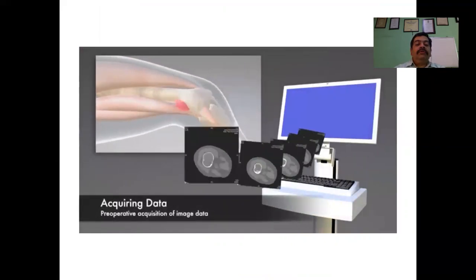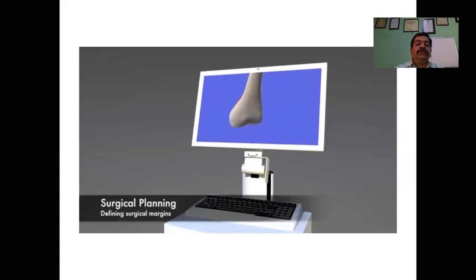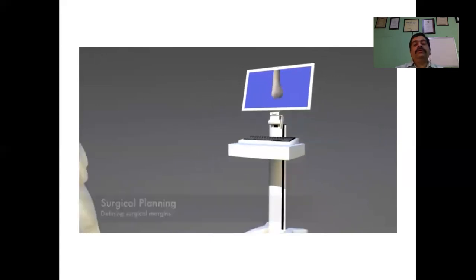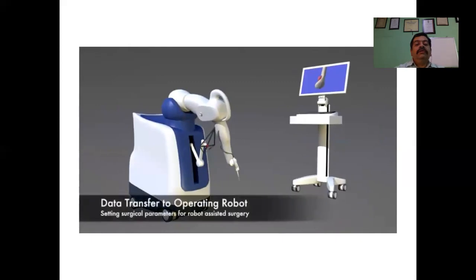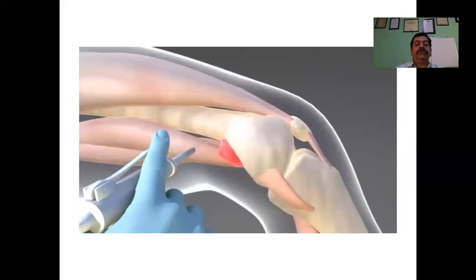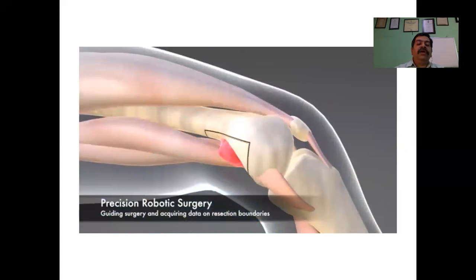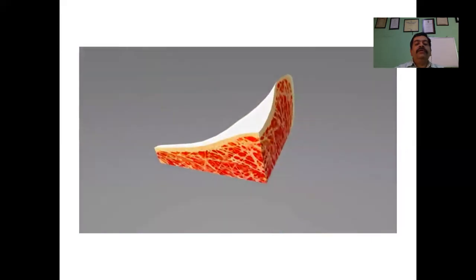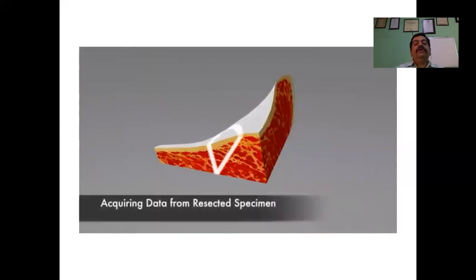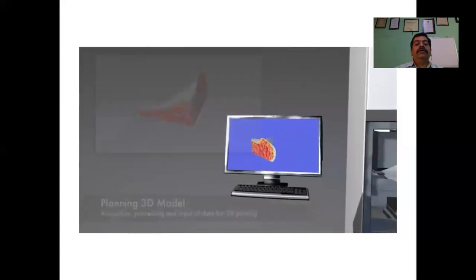you scan the limb, you acquire the data, you plan your resection. The resection plan can then be transferred to a robotic arm, which can then use that data to do an accurate resection of the tumor intraoperatively, which allows you to give a limb sparing as well as a joint sparing surgery. The resected model can be very quickly scanned intraoperatively, and the same data can be sent for creating a solution which can be reimplanted within the OR.